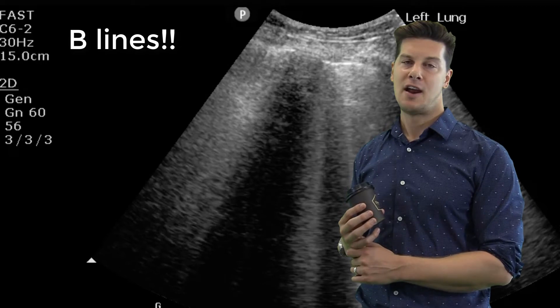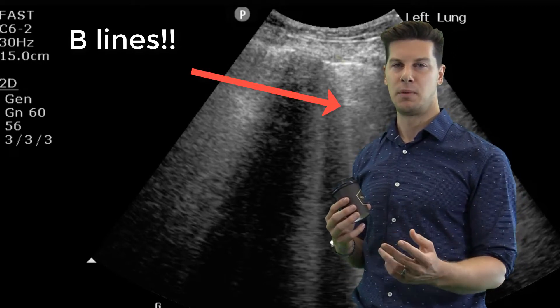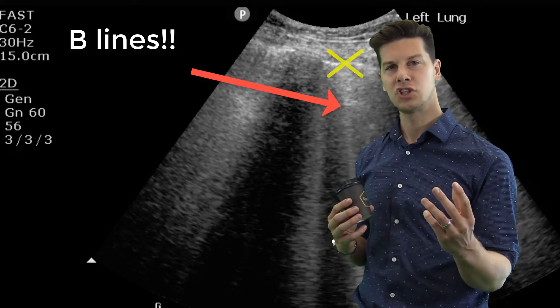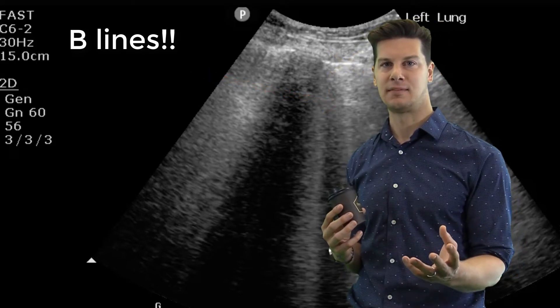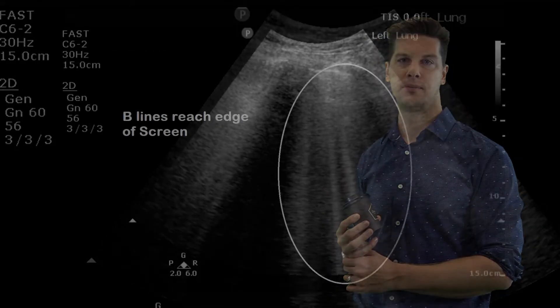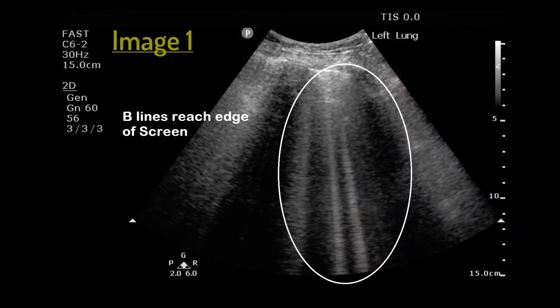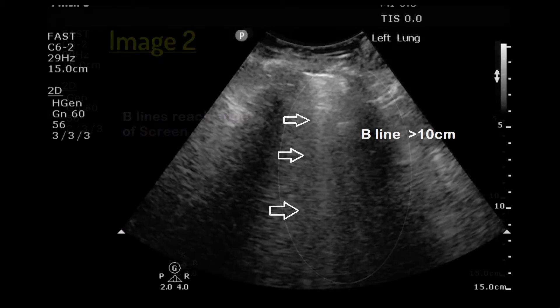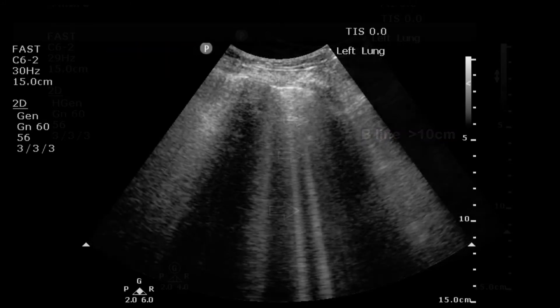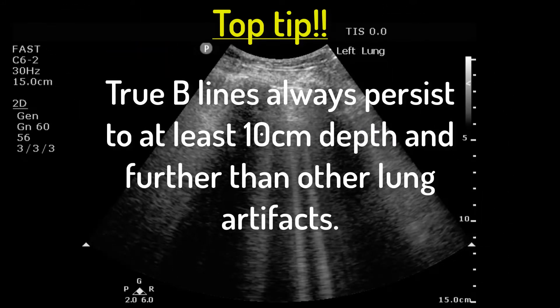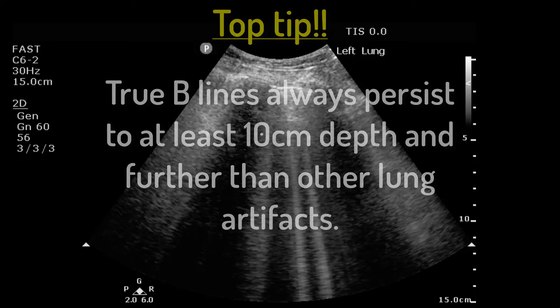B lines are narrow vertical artifacts arising from the pleural line. Traditionally they're said to run to the edge of the ultrasound screen, however this is not always the case, as we will see in these two examples. It's more true to say that true B lines always persist much further than other lung ultrasound artifacts, which tend to fade out at about five centimeters. B lines always persist at least 10 centimeters.